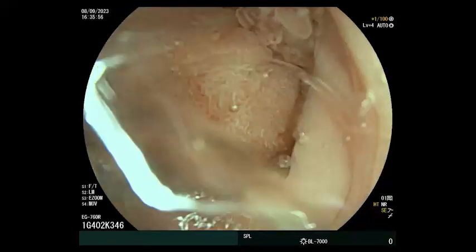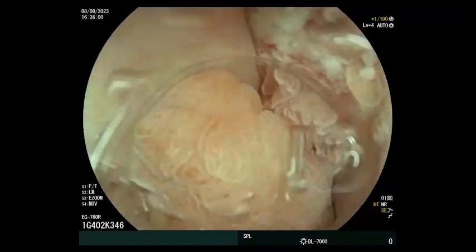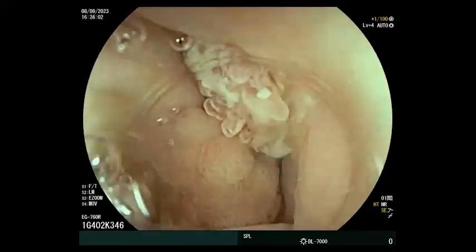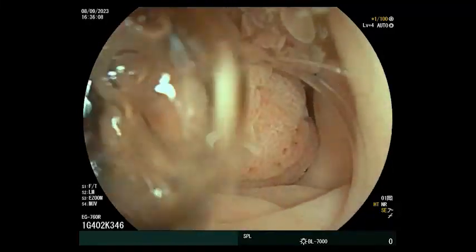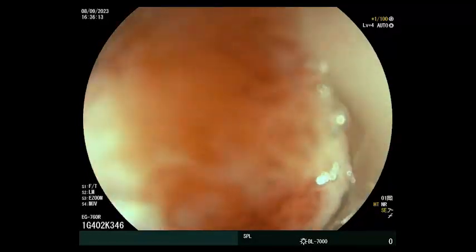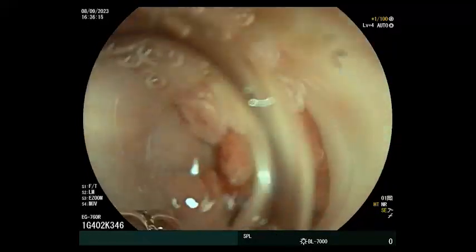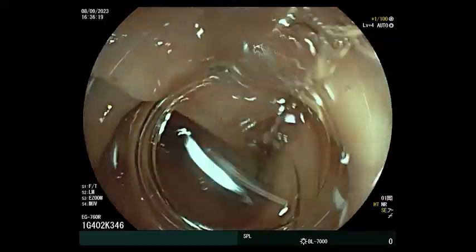You can see this is the head. It looks like an adenoma, yes, with dysplastic changes. This part is maybe high-grade dysplasia up to intramucosal cancer. And this is tubular adenoma. So we have some changes here, and the head, and this is the long pedicle. It's really a long and large pedicle.